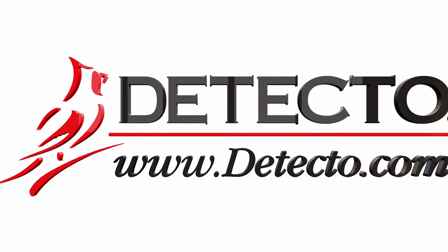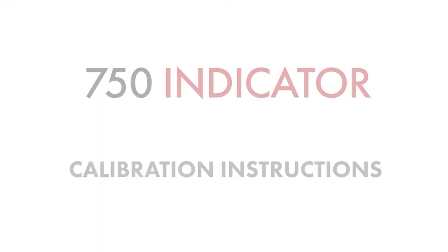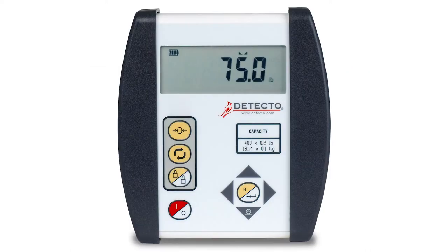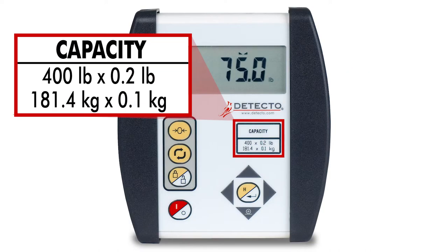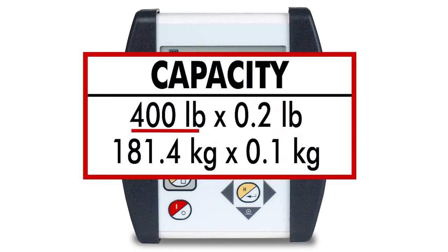This video will explain how to calibrate the weight on a medical scale using the Detecto Model 750 indicator. Before starting calibration, you should look for the capacity label on your scale's digital display and write down several pieces of information. You will need to know the capacity, interval, the divisions, and weighing units, either pounds or kilograms. If the label is missing, you can obtain the information from the serial number tag found elsewhere on the scale.